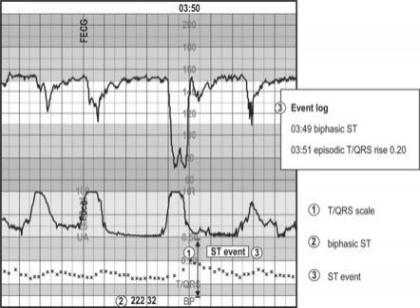But this revolution wasn't limited to anesthesia and rapidly spread through all aspects of healthcare. One of the places that had the largest effect was actually in neonatal care, because neonates thrive in a very narrow range of oxygenation. Too little can cause brain damage and failure to thrive, and too much can cause retinopathy. In the 1980s, obstetricians and neonatologists took this a step further by considering if this technology could be used to directly measure the oxygen status of the fetus. This would remove all those layers of abstraction that we've been employing to determine the fetal status.